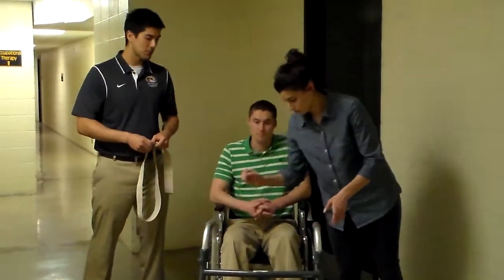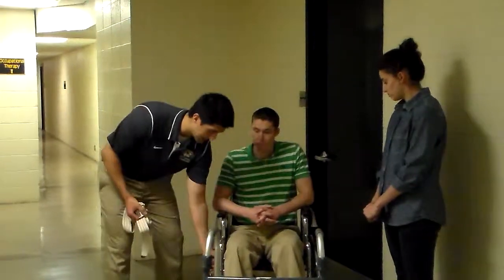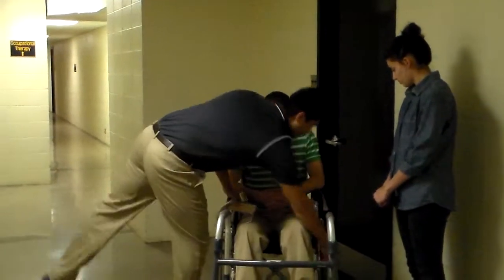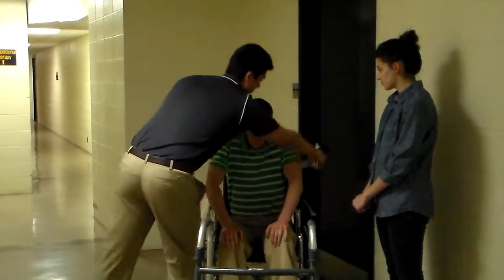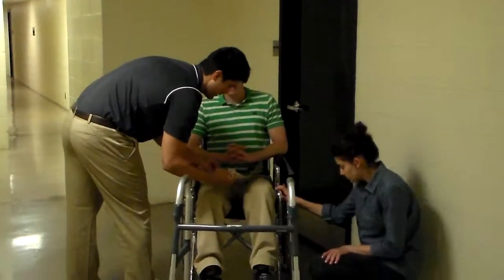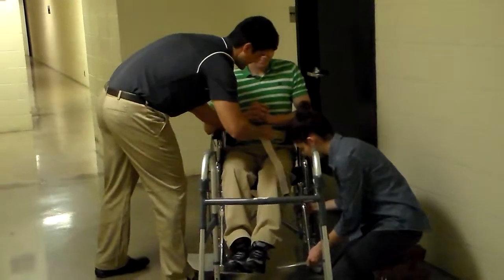So before we start, we're going to make sure we follow all safety precautions. First, we're going to make sure that his wheelchair is locked into place. Then we're going to apply a gait belt for safety. And also remove his footrests so they don't get in the way.